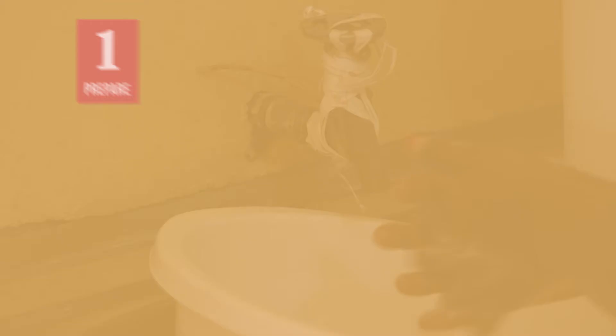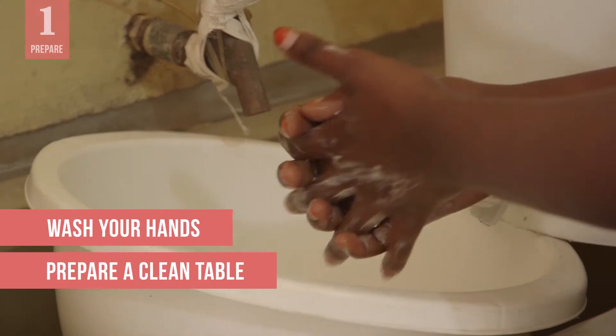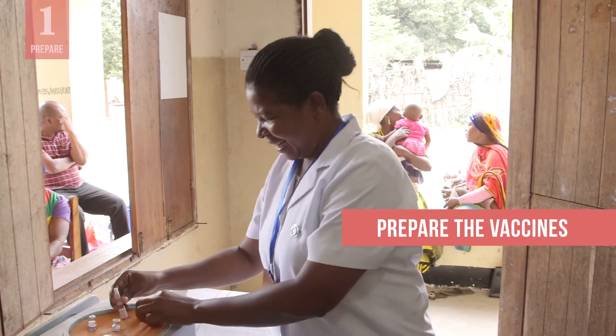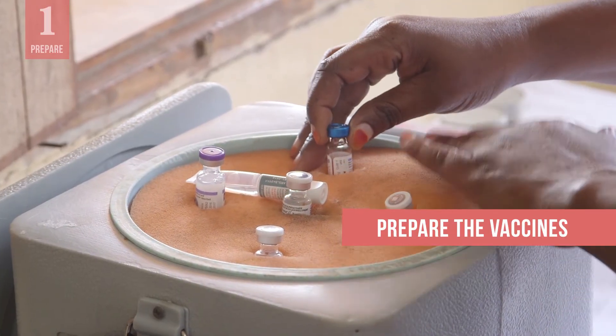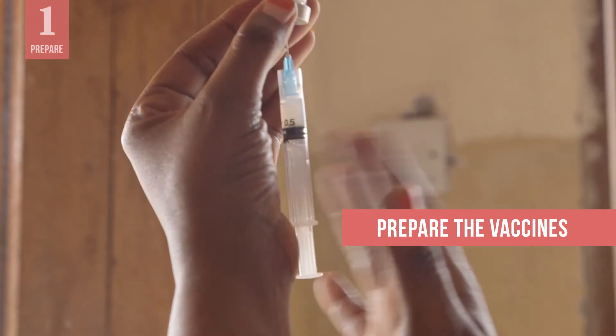Always start by washing your hands and preparing a clean table to work on. Whenever possible, prepare the vaccine away from the child and caregiver, as seeing the materials may make them feel anxious. Once you've prepared the vaccine or vaccines, keep them close at hand in the order you will be administering them.